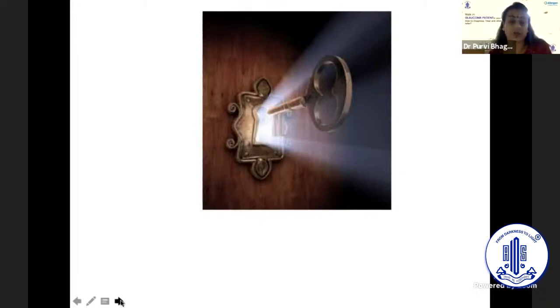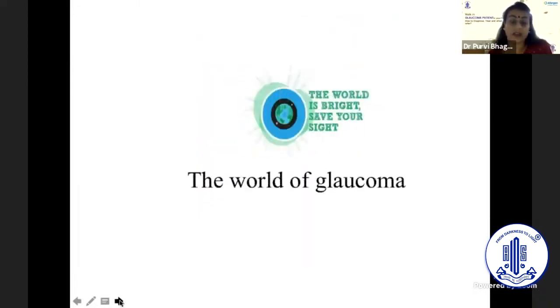So always do a good slit lamp evaluation before you subject the patient to any other investigation. It's the only master key that leads you well into the world of glaucoma.